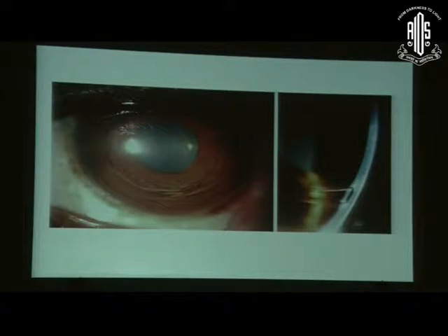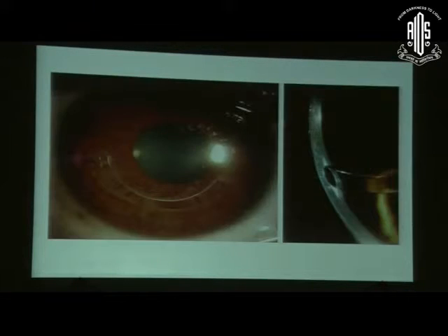So if you look at, that's the Intacs SK, what we used to do earlier, and that's the Intacs, the regular Intacs with the hexagonal outline. That's the Intacs SK. That's the nomogram that you can follow. So if you have a cone that's within the central 3 to 5 millimeter area of optical zone in the posterior float, then you use a symmetric. If it is outside the 3 millimeter zone, tend to use asymmetric. In my practice, I use more asymmetric. Most of the time, I end up using a single segment.